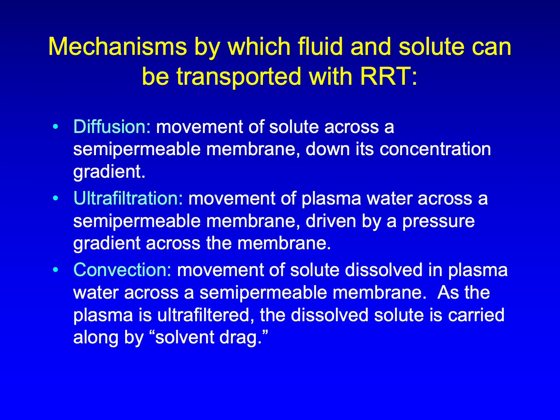Convection is the movement of solute dissolved in plasma across a semi-permeable membrane. As the plasma is ultrafiltered, the dissolved solute is carried along by convection or solvent drag.